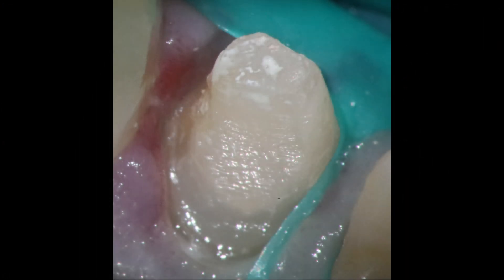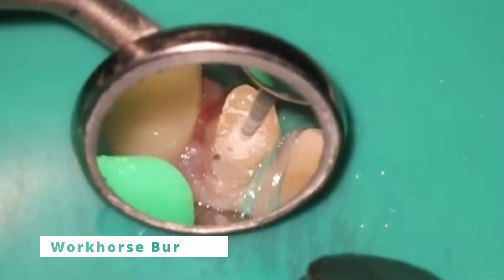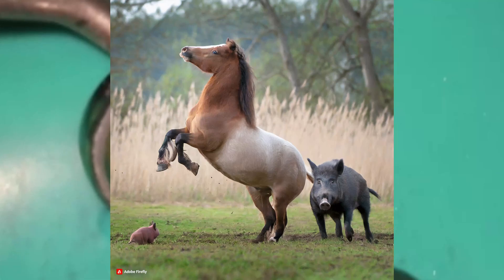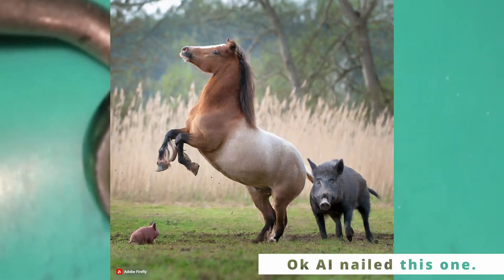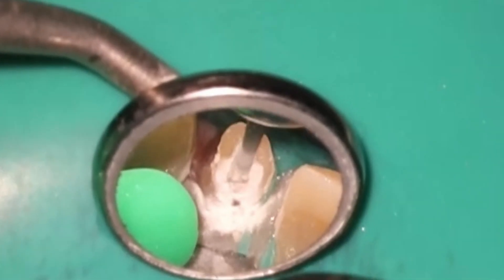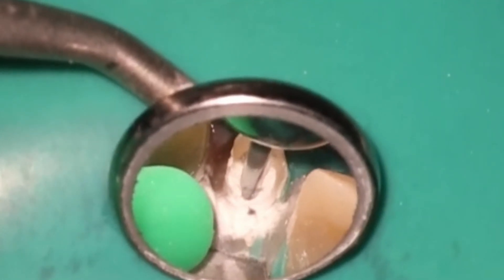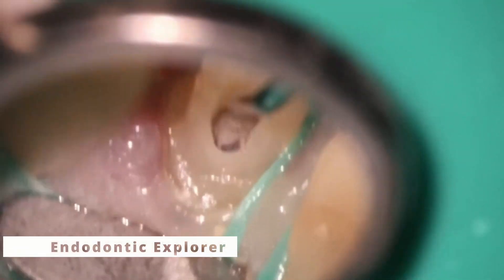This is how it presented to me. I took the temp off after we got it nice and numb. We'll show you how we take care of that. So first things first, we got to get back inside there and use the workhorse burr. What's going on here is just accessing back in, and they put a little piece of cotton on top of there.